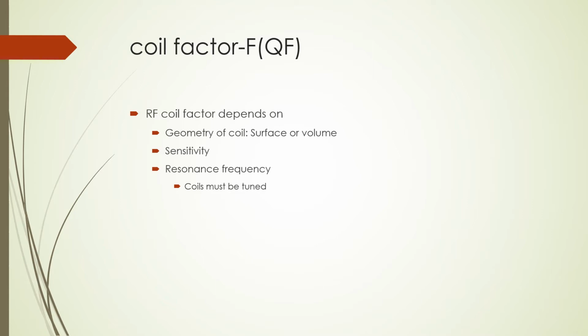A rule of thumb for surface coils is that the sensitivity decreases significantly beyond a distance equal to the diameter of the coil. So positioning of the coil is important for determining performance. Sensitivity is also limited by the presence of spurious electrical noise from electrolytes and electrically charged molecules within the patient. Improvements in image performance are achieved through increased signal rather than decreasing the noise.